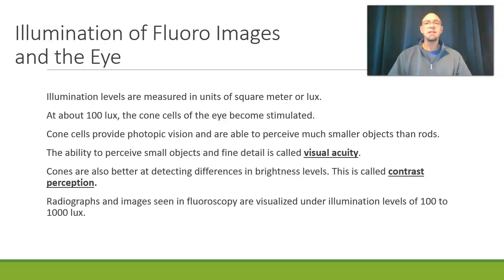So having it somewhat bright but not too bright. Obviously, when you do a fluoroscopy exam, you don't flip on all the lights and the room lights come on. You don't put on all those fluorescent lights. We usually keep it fairly dim. So you can either have a dimmer switch or you have the lights off, and the only light that you have on really is the TV monitor.